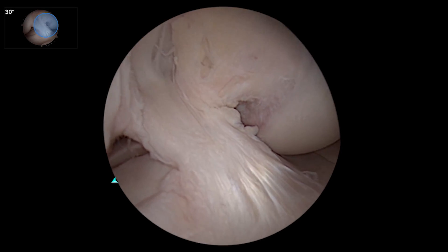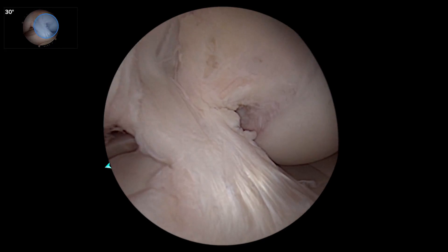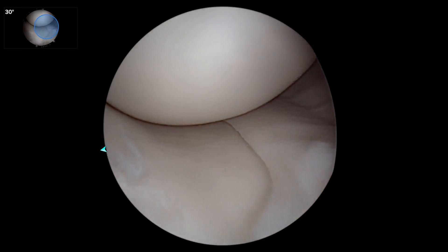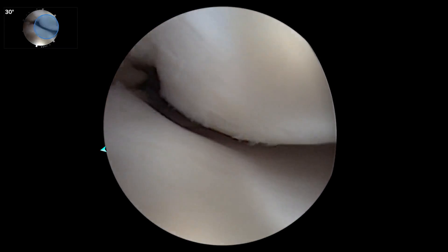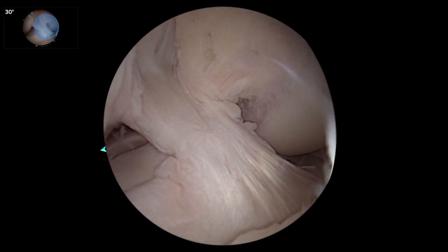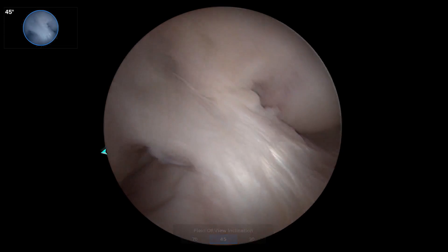So this is just your typical 30-degree view, and I'll run through it from the notch in the lateral portal — good view of the ACL — looking down at the anterior horn of the medial meniscus, coming back to the back. And then that same view, if we move to the panoramic view, we have a much broader angle.